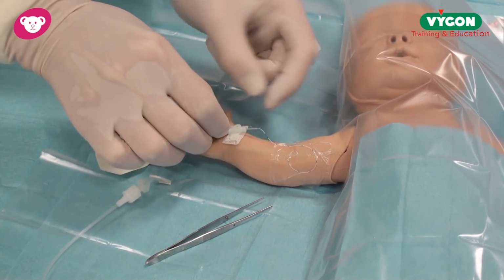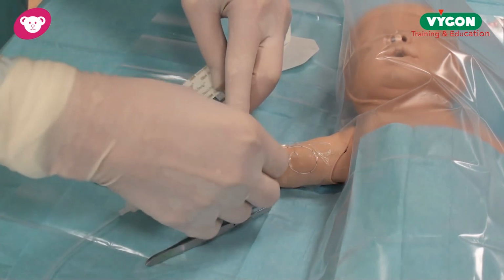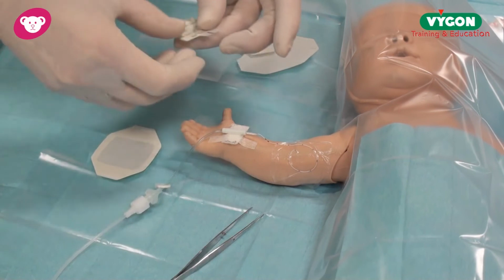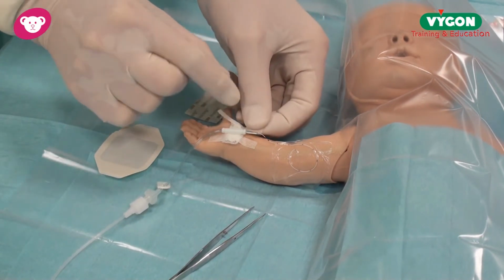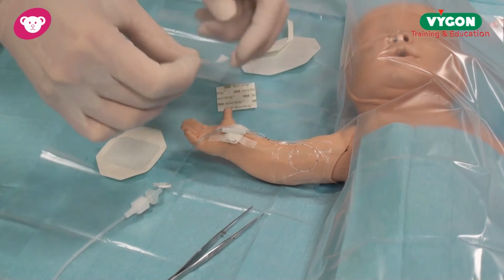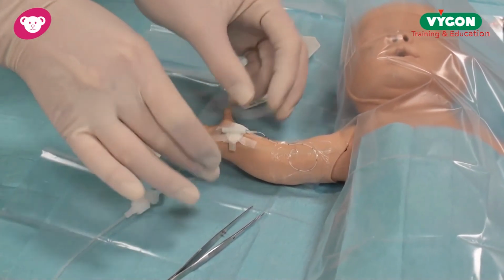This protects the baby's skin, and now I will place a Steri-Strip like so, one this side of the wing, the second one the other side of the wing, and this technique really does enhance good catheter securement, preventing any pistoning of the catheter or any movement, and avoids dislodgement. I've not quite finished yet.